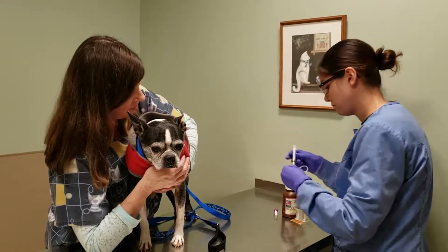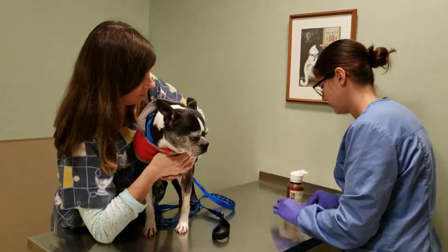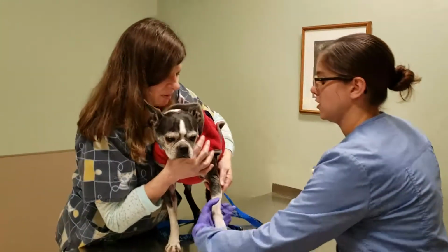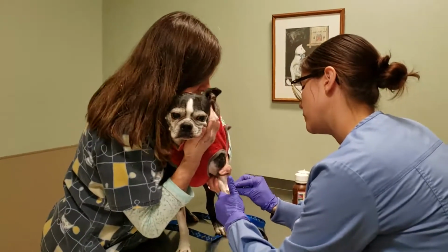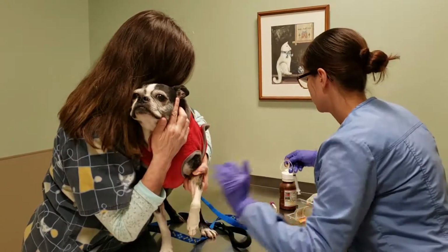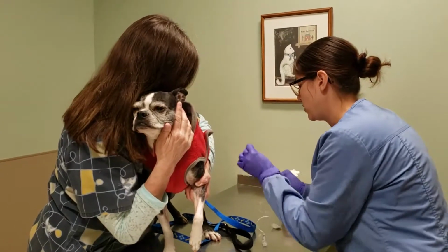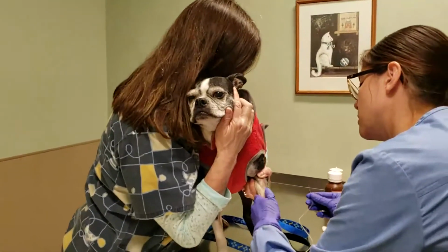You see me doing this? All right, my friend. All right, my little love bug. All right, sweetheart. We can do this. Okay. Oh, you're very brave. Okay. We put our needle in, bevel up.